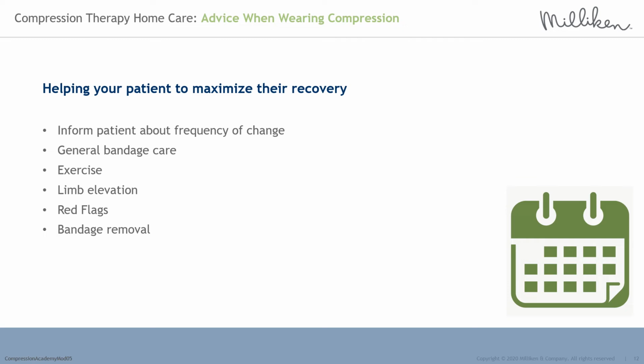The patient should be encouraged to exercise their foot and leg and not to stand for long periods of time, but also to walk frequently. This is to maximise the effectiveness of the squeeze and release of the compression against their limb to help empty their deep veins. Patients should also be asked to elevate their limb whenever possible. The higher the leg, the lower the blood pressure will be in their veins. The use of pillows and footstools is also recommended.